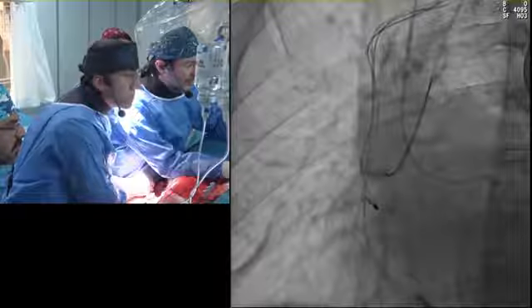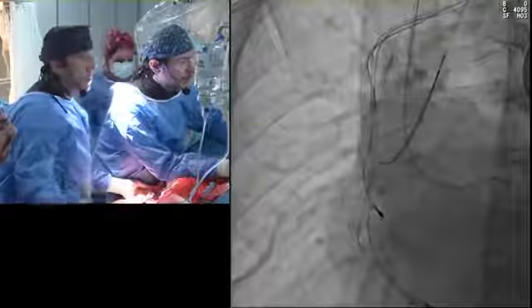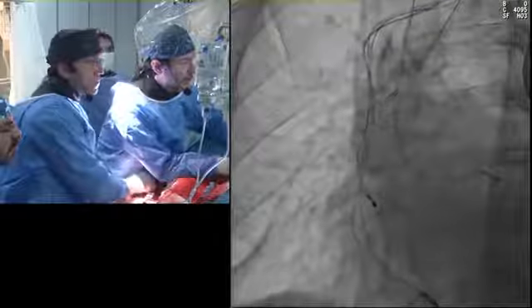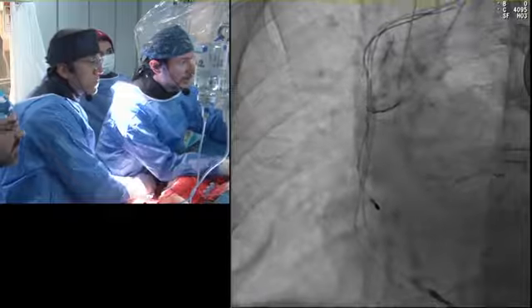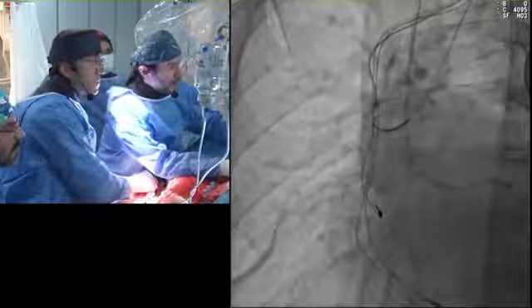He injected in it. Almadı ya. Yok. Boşta. Şimdi dene Şeref. I'm afraid snare and retrograde wire are in a different space. So the area projection would highlight those kinds of distances. Hadi sağ cranial'e gel.